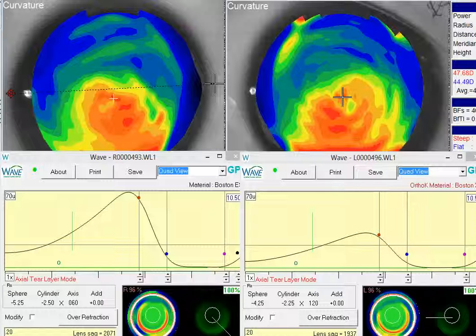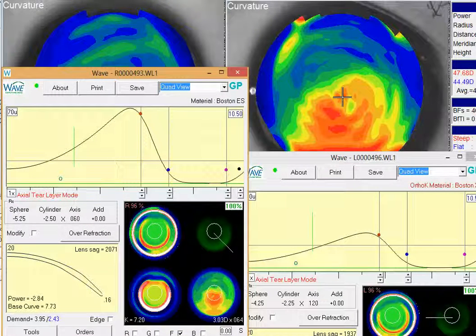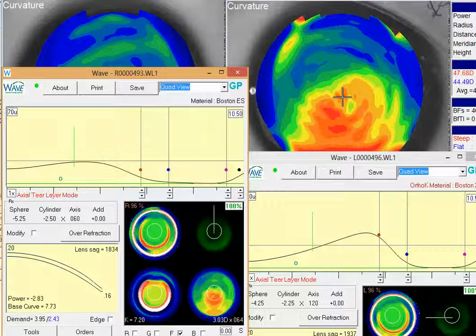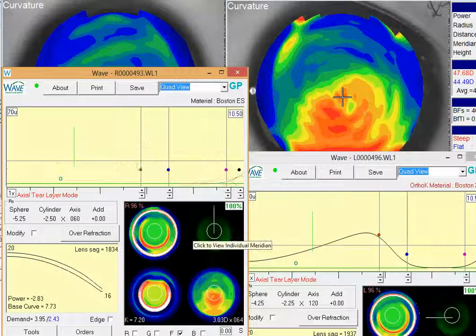If we look at the designs for a moment, the first thing I notice is these lenses are kind of a reverse geometry design, as you probably know. In fact, if you fit many ortho-K lenses, this looks pretty much like an ortho-K design on this cornea, which sounds like it's worked pretty well so far at this point.